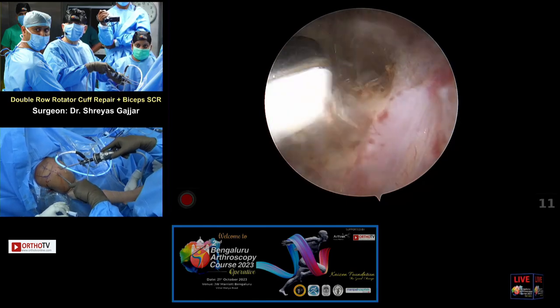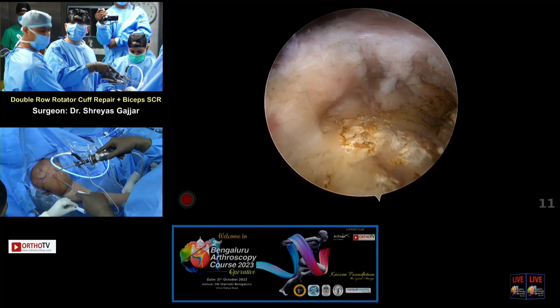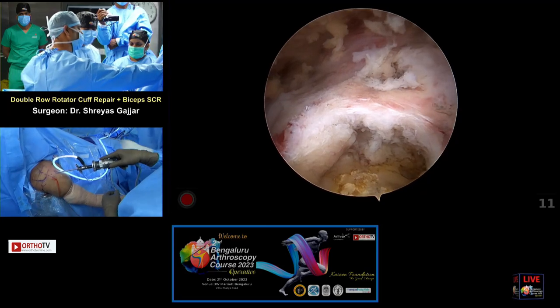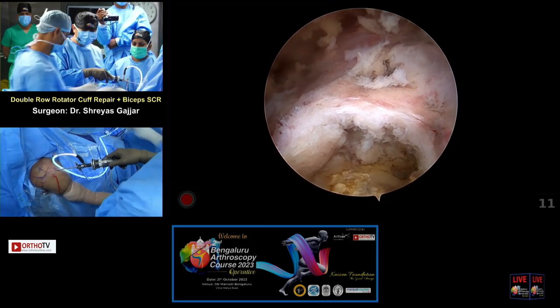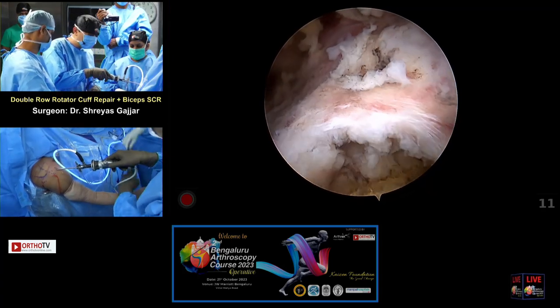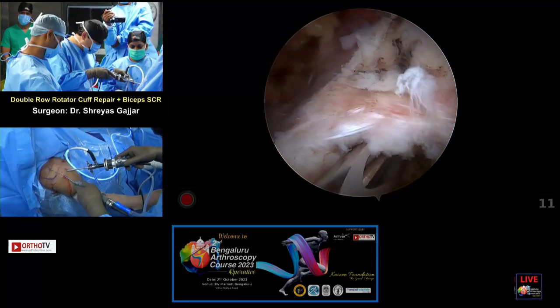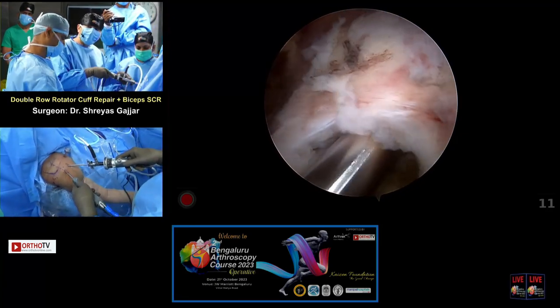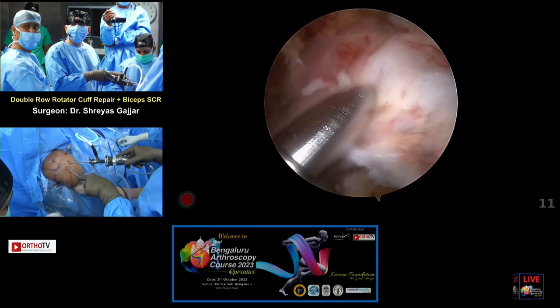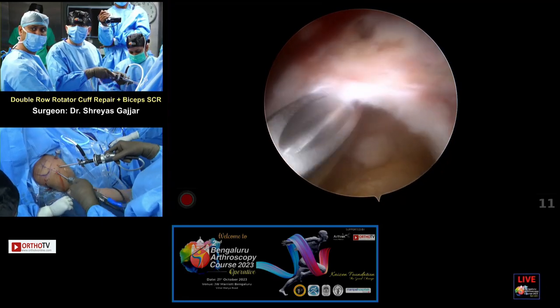So your thoughts on using knotless anchors? Yeah, I've been using knotless anchors for a couple of years now. I'm quite happy with it. Apart from the issues with knot slippage, loop security and prominence, I find it quite easy. The only challenging part for anybody who uses it is not to over-tighten with the knotless. So, I'll hopefully share a tip on how to minimize that.